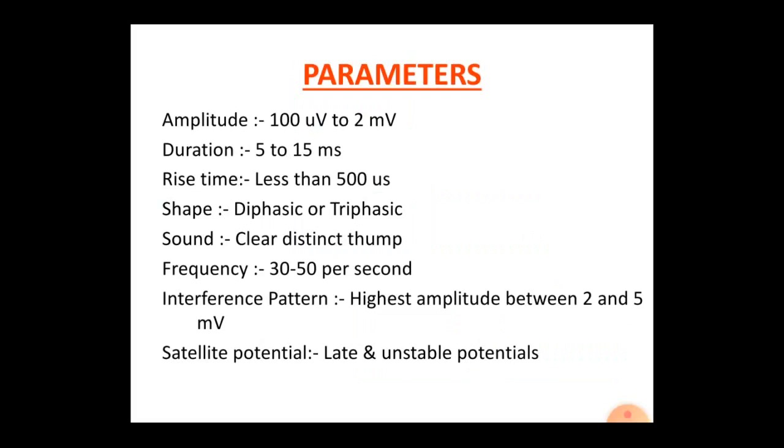Now all these parameters you have to remember, you don't have any choice. Amplitude is ranging from 100 microvolt to 2 millivolt. Duration is from 5 to 15 millisecond. Rise time does not have much clinical significance, it is lesser than 500 microsecond.